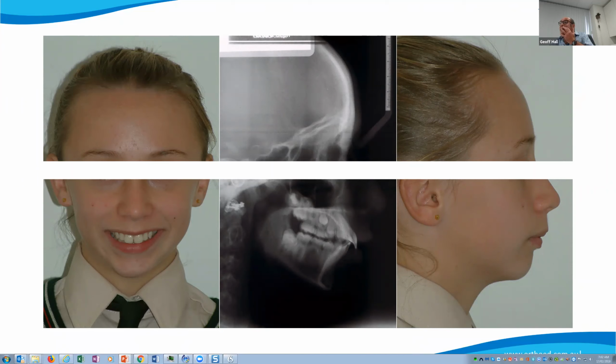So this is a fairly interesting case. Virginia, I'm going to get you to start. She's class 2-ish in skeletal, but the molars, yeah, they're not badly out. She's missing a lower, well, probably both lower fives. The sevens are impacted, and it looks like she's missing... Hold on a second.